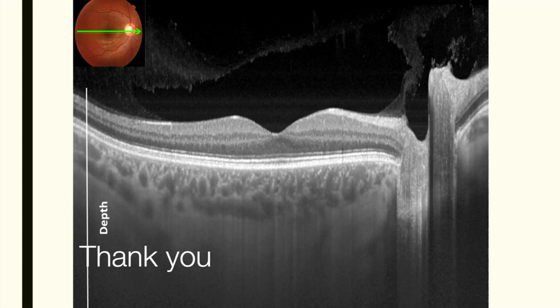So when do you prefer OCT and OCTA if there is a doubtful area, doubtful NV or asymmetric DR cases? So you can do a montage, which is non-invasive, and I combine it with the fundus photograph also. See what you see clinically on an indirect. Major advantage of fundus photography is you can magnify it and see any IRMA, any small red dot which appears on indirect. You increase it in size and see whether it is an NVE or anything. So those doubtful cases I am able to get away with fundus photograph.